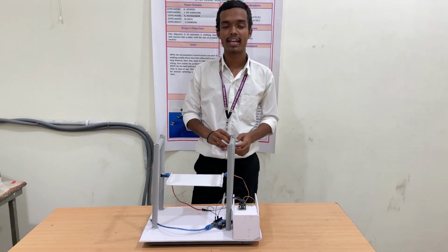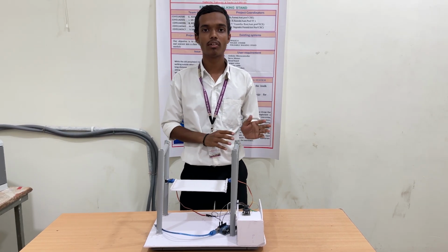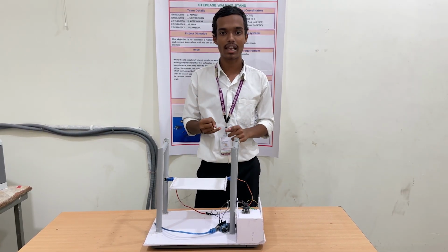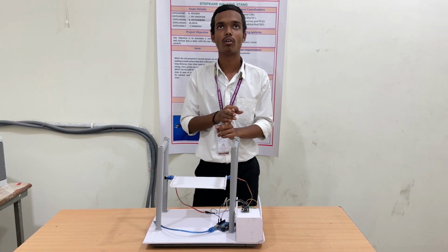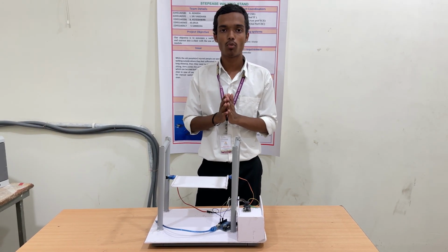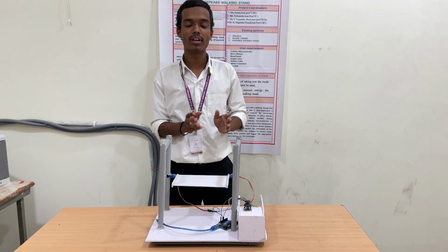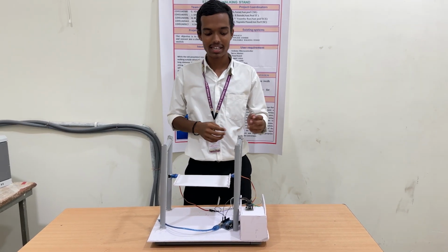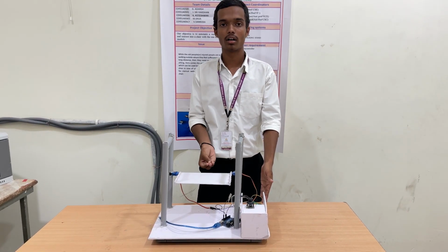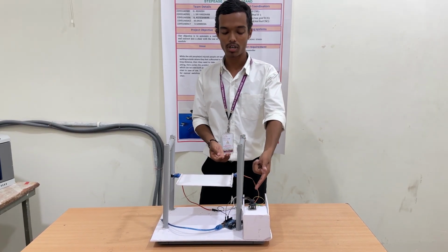To explain about the existing solutions for our project, we found there are some existing solutions like Walkie iWalk 2.0 and Walkie Combi, and one more is the foldable walking stand. When we come across these 3 items, we have manual opening and closing of a chair, whereas we made this project to make the step easy by controlling it with the Arduino.